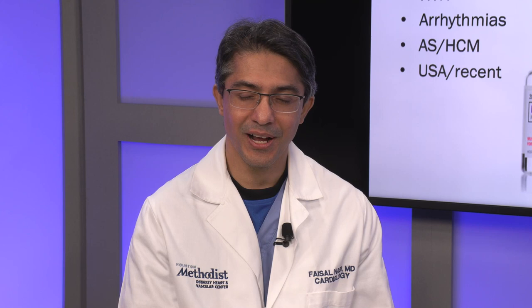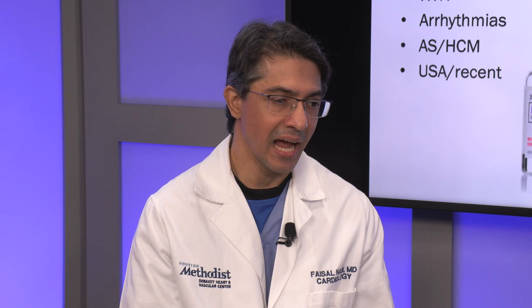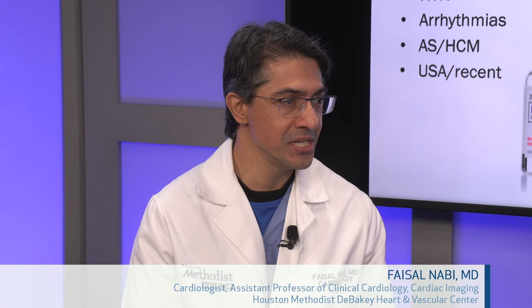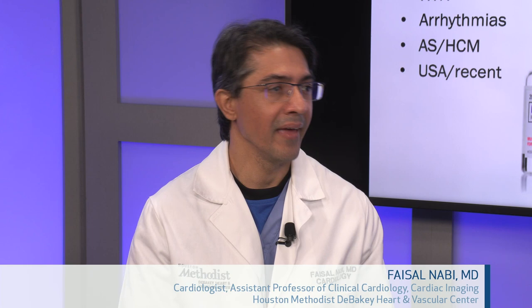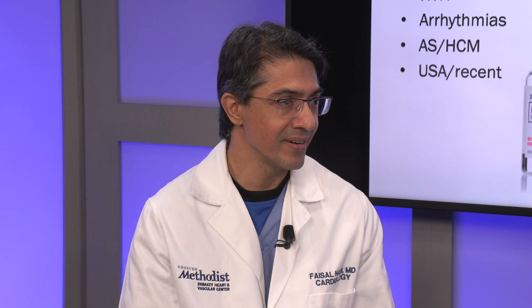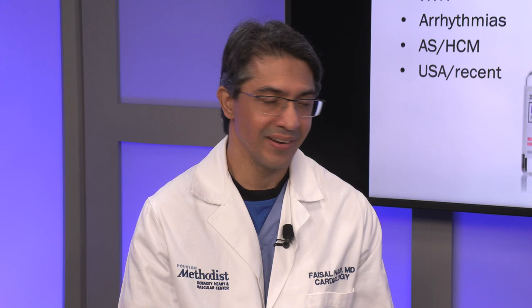Yeah, this is a condition that is unfortunately not uncommon and always puts us in a bind. The scenario here is where we really need to do some sort of stress test. And in this patient, I would probably go with rest imaging. If we were to do myocardial perfusion imaging with nuclear agents, I would proceed with rest imaging first. It would allow us time, hopefully, for the caffeine to wear off further, and then do stress as the second test. If you have the ability to convert to a different test, then you can consider moving on maybe to an anatomical test instead, if the physician agrees. And then, although we don't like to use it, there is dobutamine, but dobutamine, of course, has a much larger side effect profile.